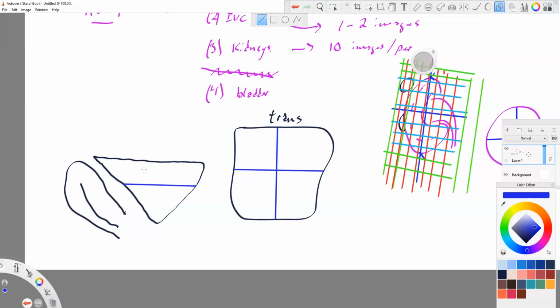Because of the triangular shape of this bladder, I think it's best to take a fair guesstimate, and this is a guesstimate, your decision, not mine, you are the tech, on where to put that third and final measurement, and then it'll give us a nice volume of 100 cc's or whatever. By the way, a cubic centimeter is equal to a milliliter, so I should put an equal sign there, just so you know. So 100 cc's, 100 milliliters, same difference.